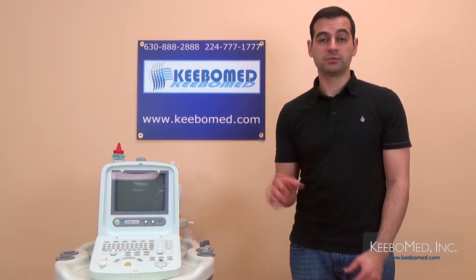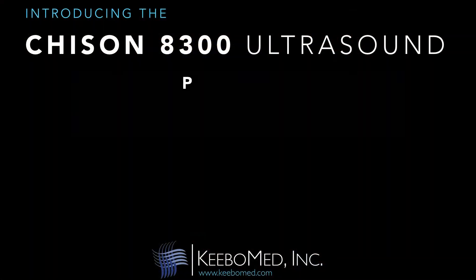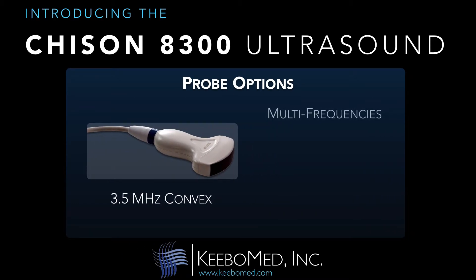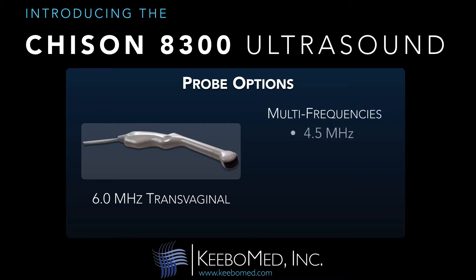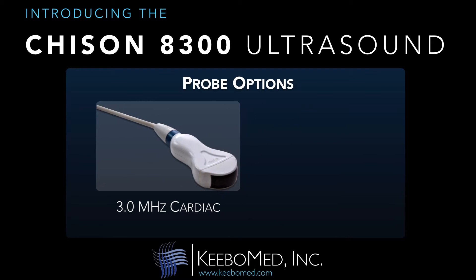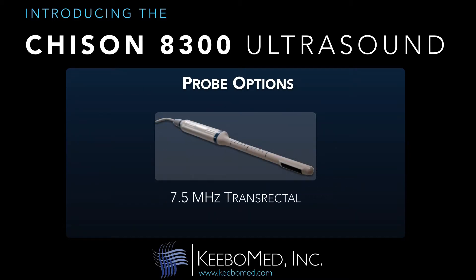There are five different probes available for the 8300, and they all have four-step multi-frequency options. They include a 3.5 MHz convex with multi-frequencies of 2.5, 3.5, 4, and 5 MHz. Also, a 6 MHz transvaginal is available with multi-frequencies of 4.5, 6, 7, and 8 MHz. Also, a 3 MHz cardiac probe is available with multi-frequencies of 2, 3, 3.5, and 4.5 MHz. A 7.5 MHz transrectal probe is available as well.